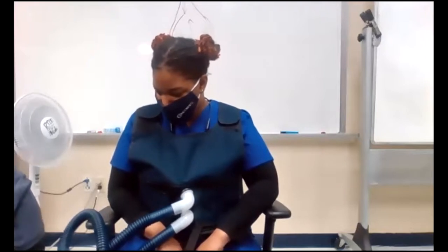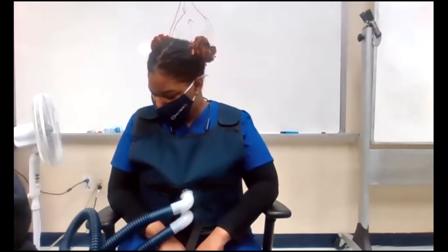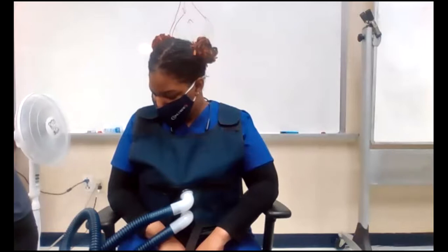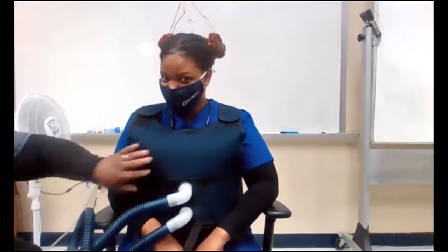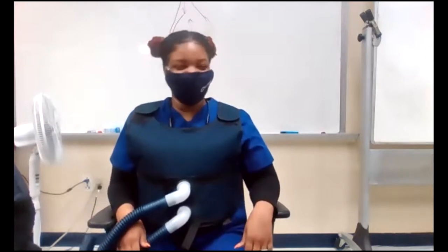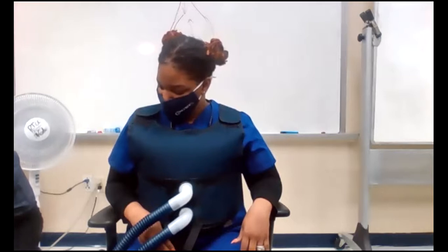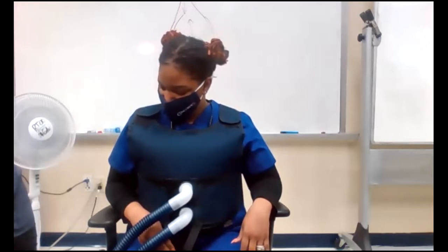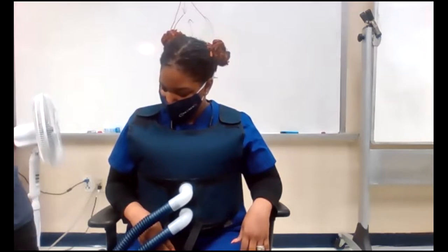Turn it on. Let's do this little thing. Now turn it on, it's gonna start to inflate. Notice how this is inflating now. Feel it? Yeah. All right, I got it set at 19 hertz. All right, and then you can set the timing, you can set the pressure and how long it lasts, okay? Now I'm gonna start. When I press the start button, she's gonna start to shake. You tell me when to stop, if I need to stop.